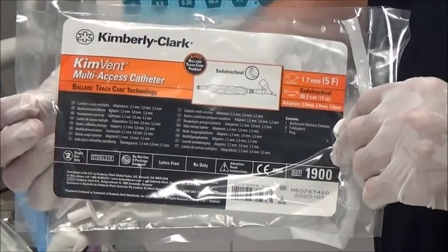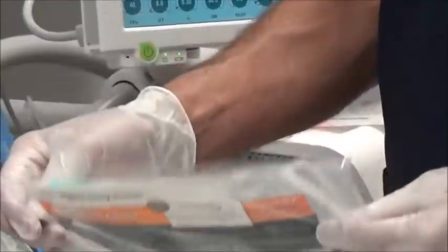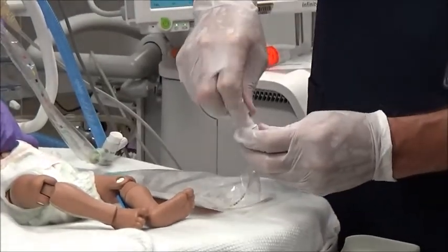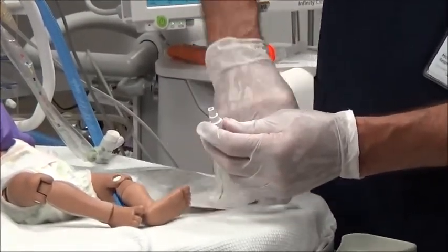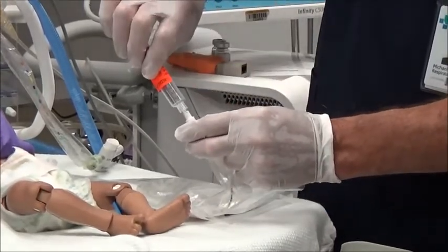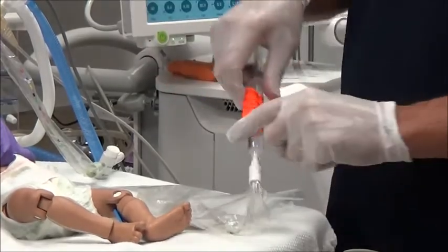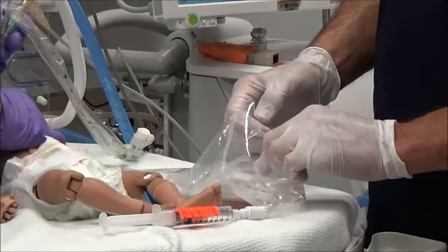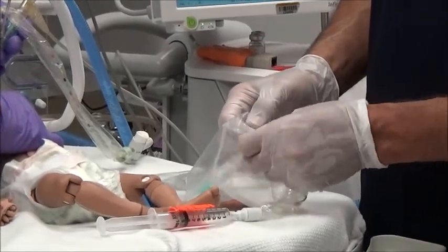Prepare the correct medication dose to be administered over the correct number of aliquots as per clinical practice guidelines. Attach the syringe with the surfactant dose to the MAC catheter Luer-lock. You must ensure the cap or syringe is connected to avoid a leak. Place the white cap into a sterile package to maintain sterility.